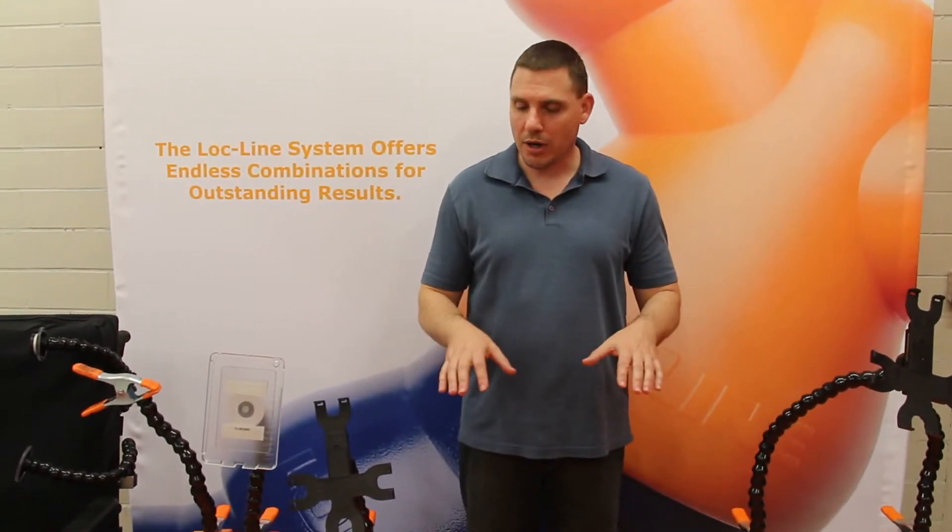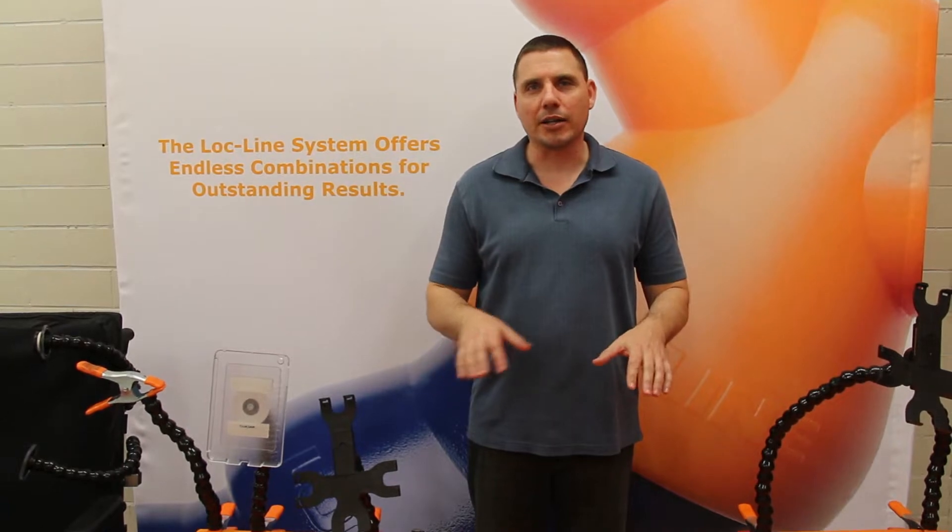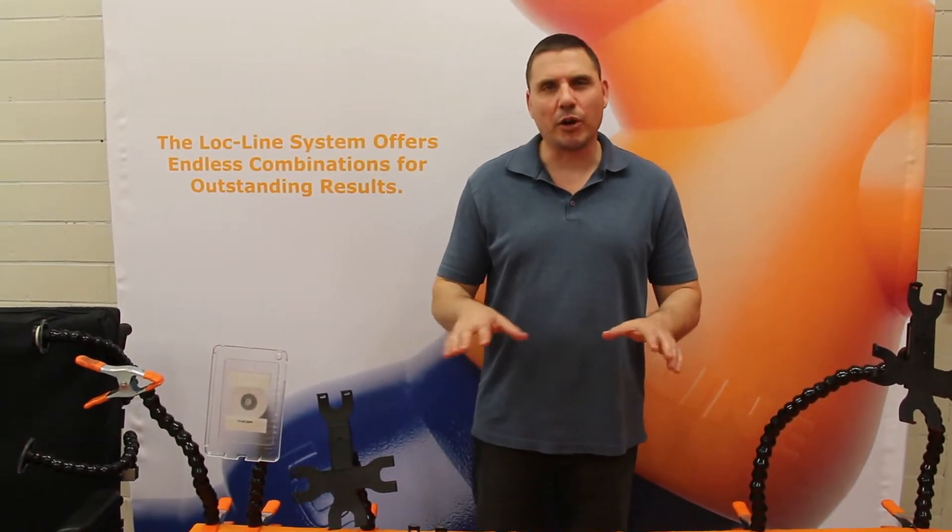Hi, in this segment we're going to go through some of the basic components with the lock line so that you can get familiar with the various components and a little bit of how you would use them.